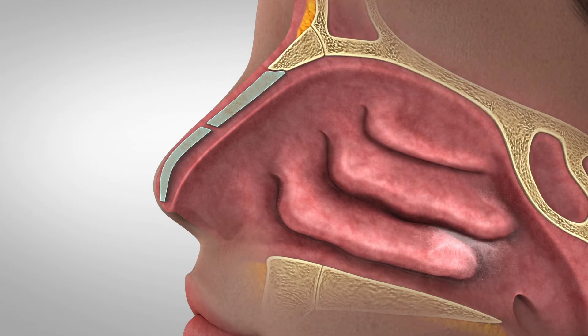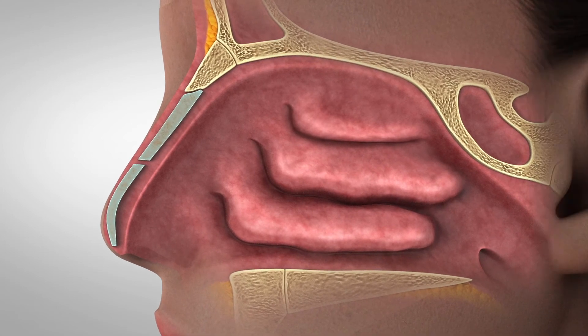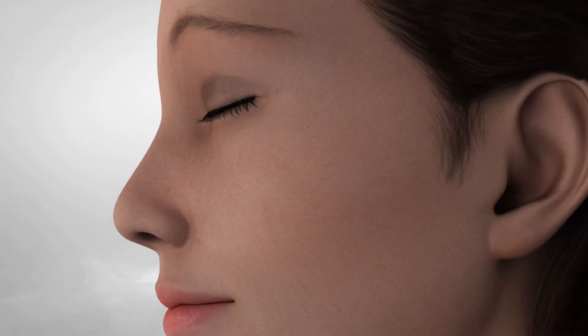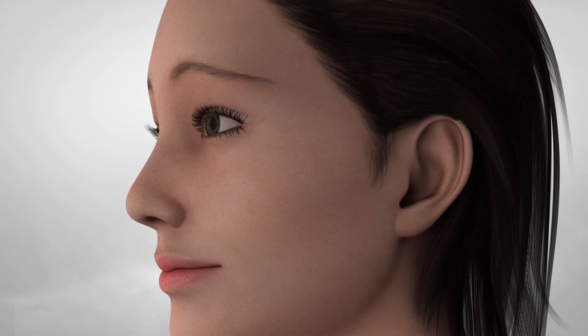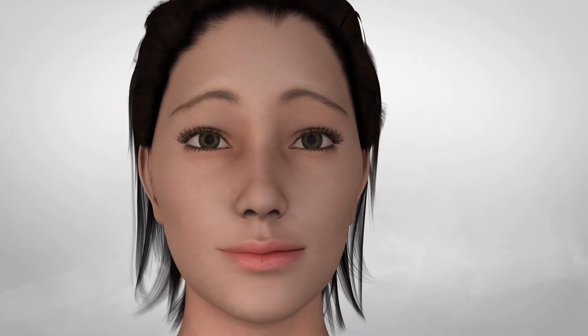Rotate the probe and repeat these steps for the contralateral nasal passageway. A clinical study demonstrated that the Clarifix device was safe and delivered significant relief of chronic rhinitis symptoms with minimal downtime and recovery.